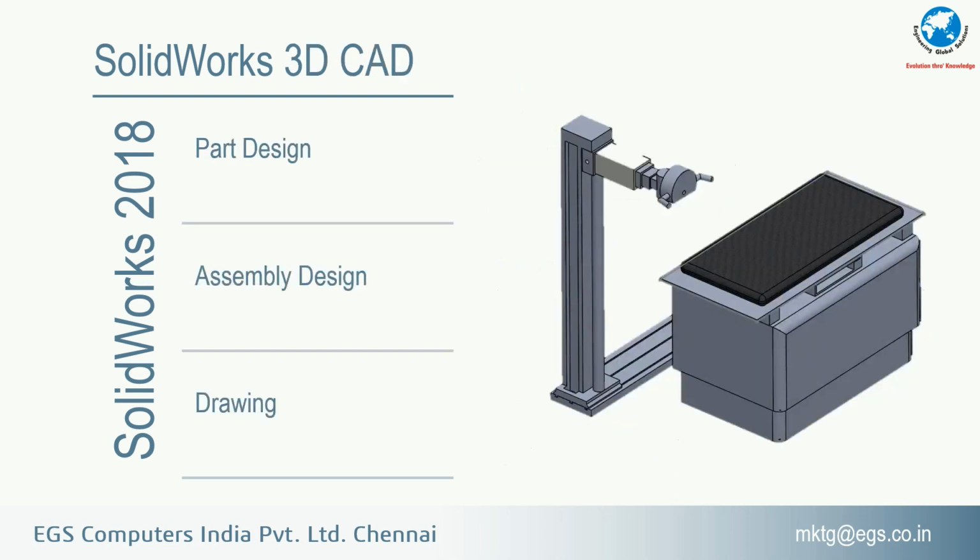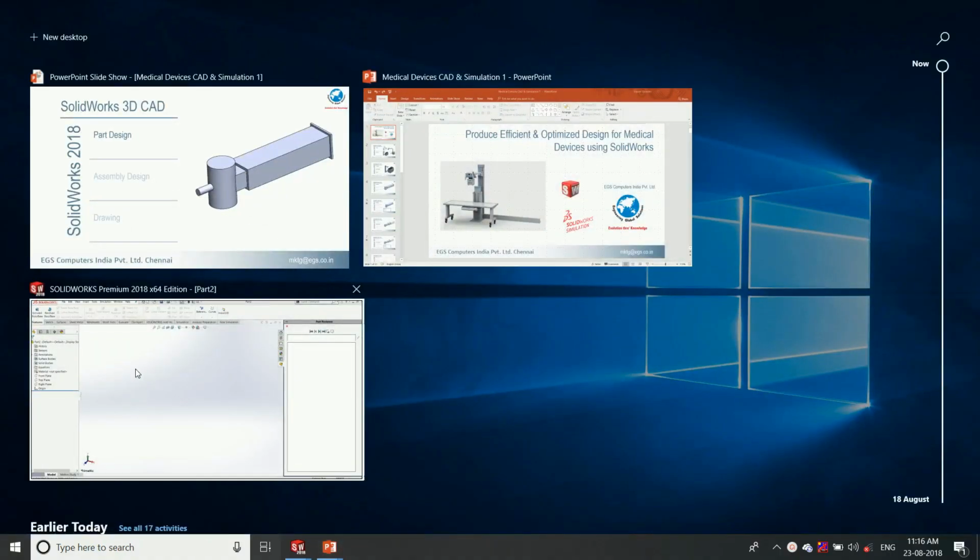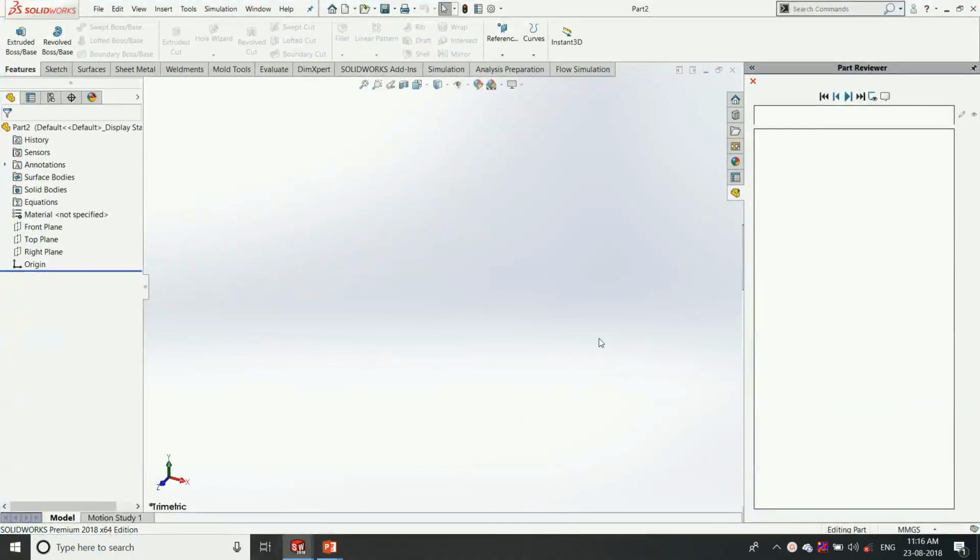Now, let us see what possible solutions are available in 3D CAD SOLIDWORKS for designing X-ray machines. In this list of designs, for example, part design, assembly design, and drawing, we're going to see a step-by-step process of how efficiently and user-friendly we can design the parts of the machine. This is the SOLIDWORKS window where we can design, and all the options are available here.